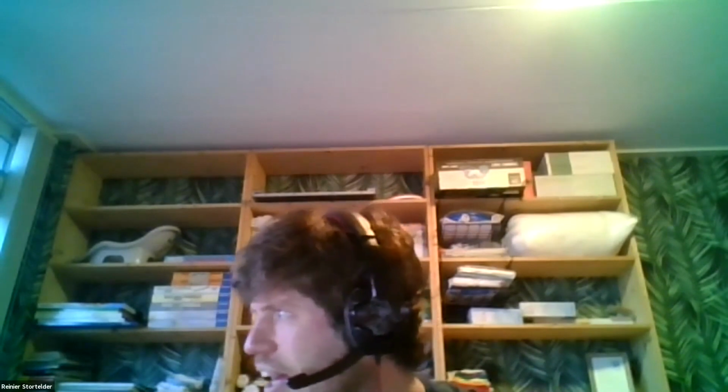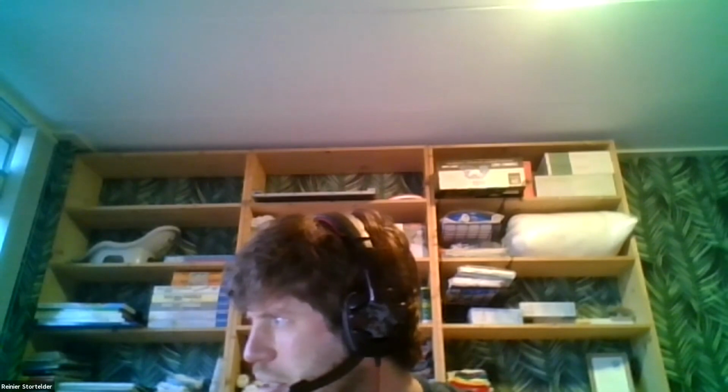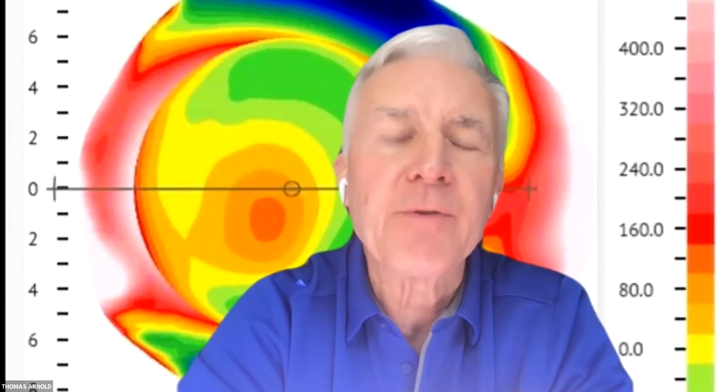And now back to your question related to the bi-elevation lens, I'm trying to see if I can explain this better. Hi, Aaron. How you doing? Hey. It's an excellent question. I use the tangent angle map as a confirmation of the bisphere elevation map. Kind of 2 different ways of looking at the same thing.